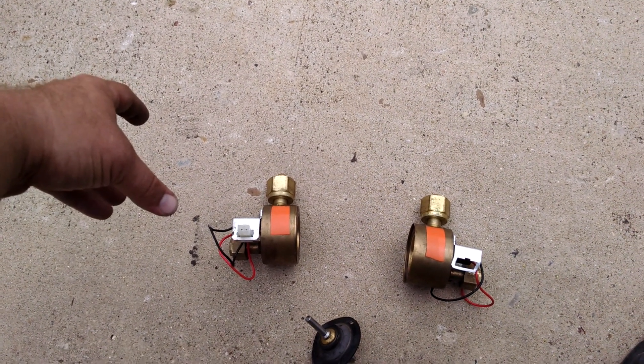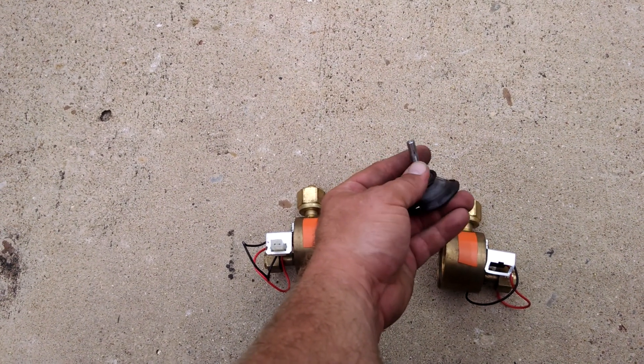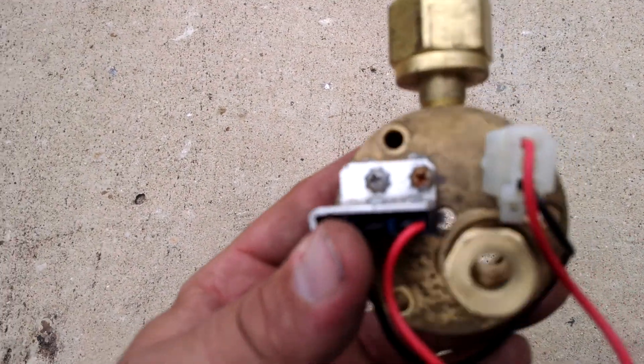At least that's how it's working in theory. On this one, somehow oxygen was getting past this rod coming out the hole on the side here. See it there.